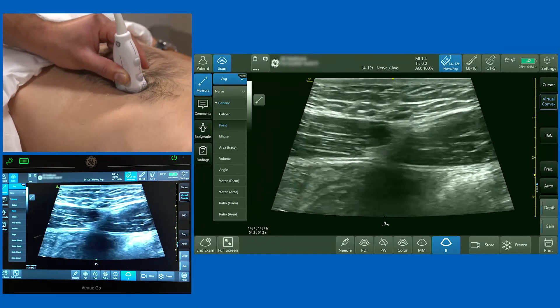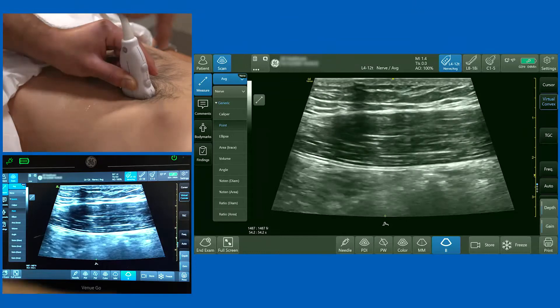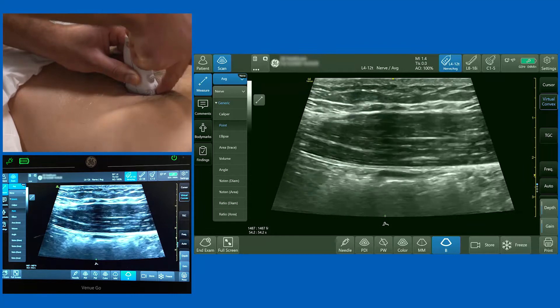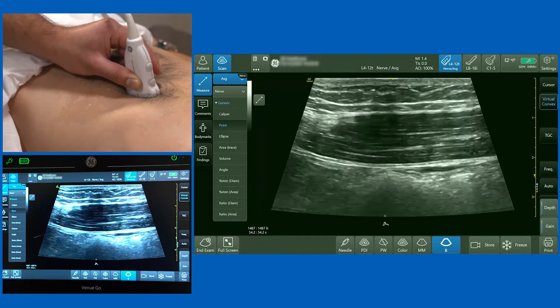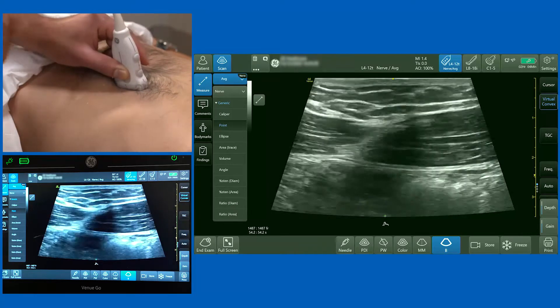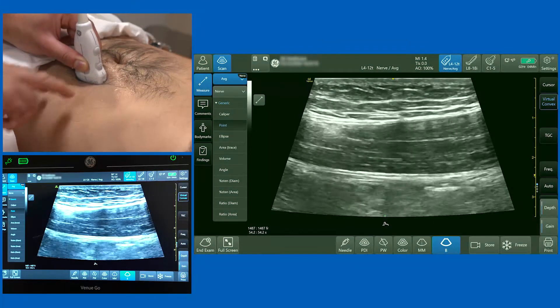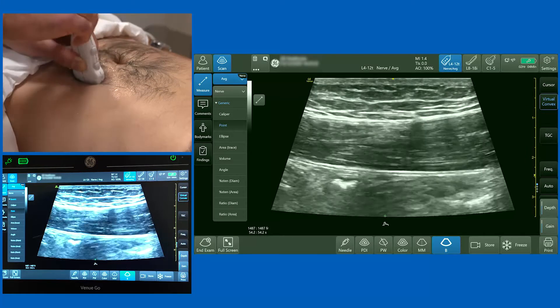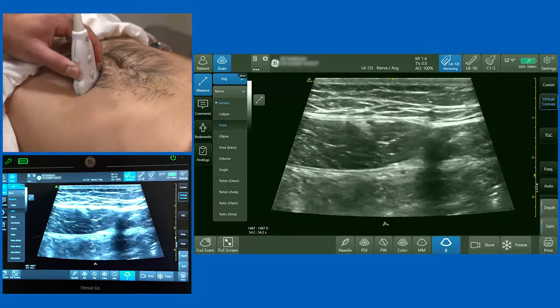Having generated a long-axis view of the rectus abdominis muscle, this is a nice way to direct a catheter for post-operative analgesia after a laparotomy. Bringing the needle in from the superior aspect, you can pass it through and direct local anaesthetic between the muscle and the posterior rectus sheath, allowing it to spread along the long axis of the muscle. For this block, approximately 20 mls of local anaesthetic on each side should give a nice spread. Rotating the probe back through 90 degrees returns you to the short-axis view.